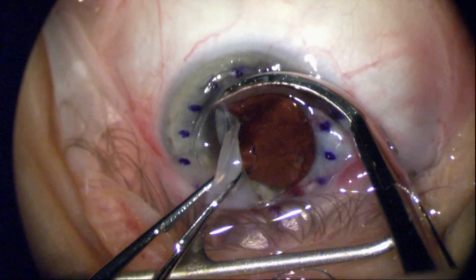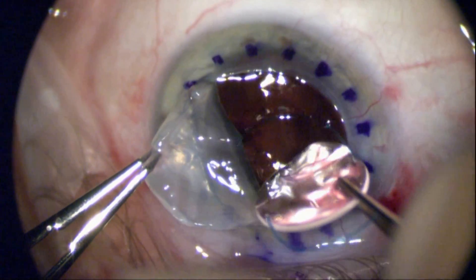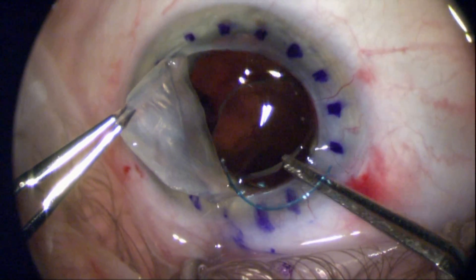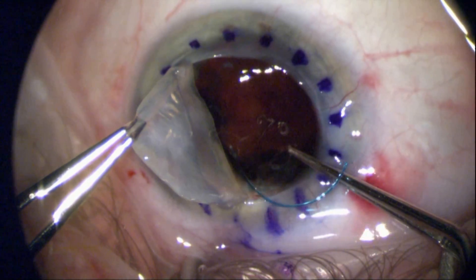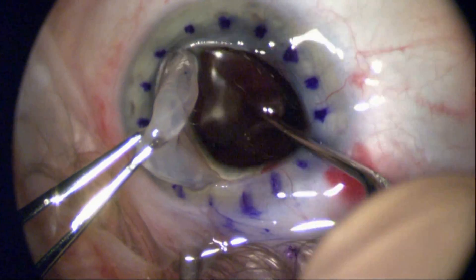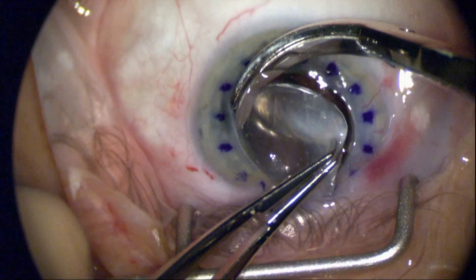I don't want to remove all of this right now, just in case there's an untoward event like a choroidal hemorrhage or something like that, which would require me to close the system quickly to gain control. So I can just peel that cornea back and place the three-piece lens in place.